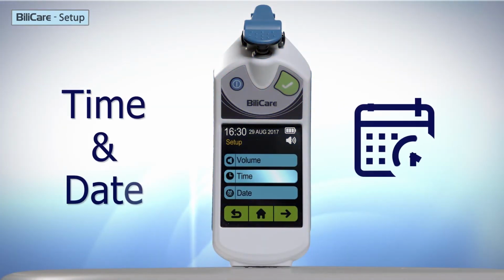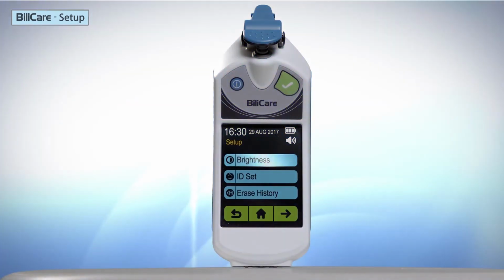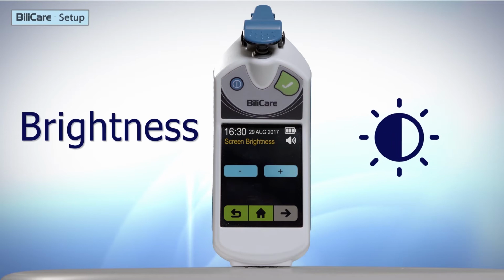Time or date key. Press the field that you want to update and update it using the plus and minus keys. Screen brightness may be changed using the plus and minus keys.